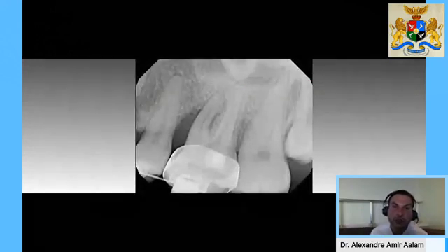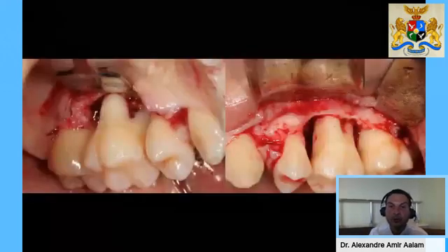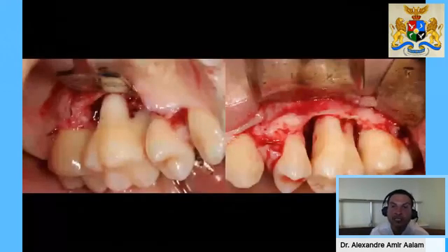So having this beautiful concept, this is the first surgery that I did back then to try to confirm this proof of principle for myself and for the group of research with Joseph Shukroun. So this was a patient that suffered from an advanced localized periodontal disease, and we needed to do a regenerative procedure to try to save this tooth.